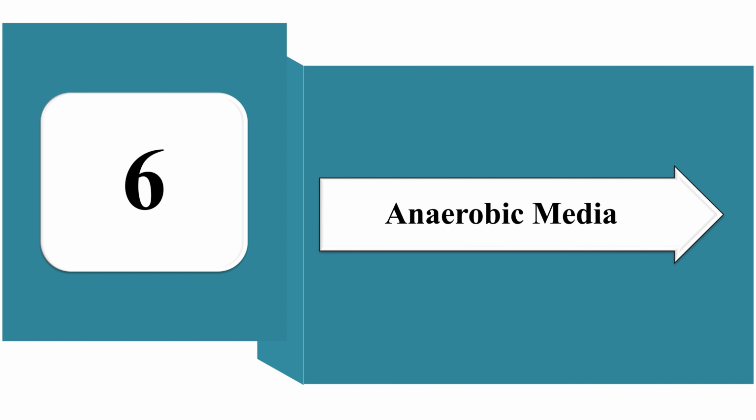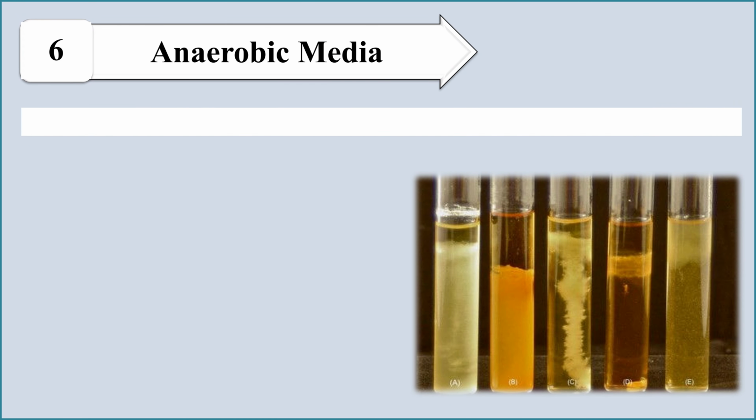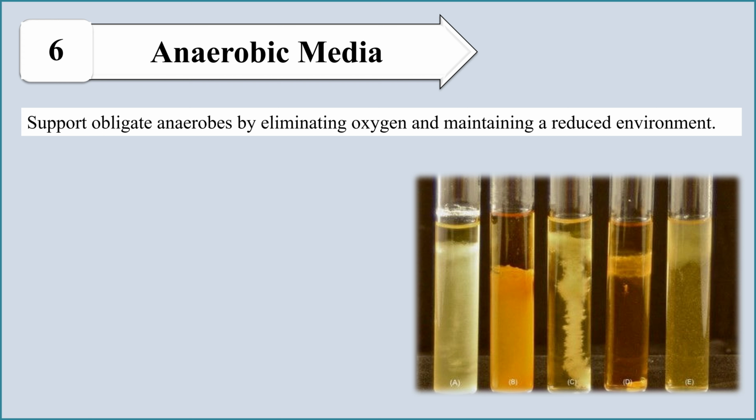What is anaerobic media? These media are used to support the growth of obligate anaerobes by eliminating oxygen and maintaining the reducing environment for the microorganisms or bacteria.